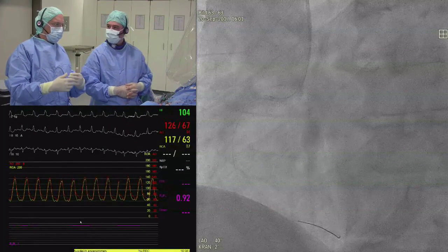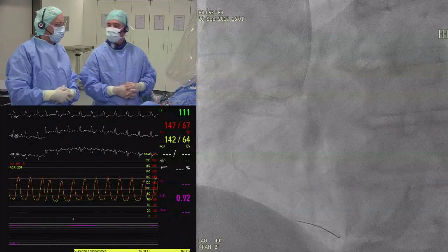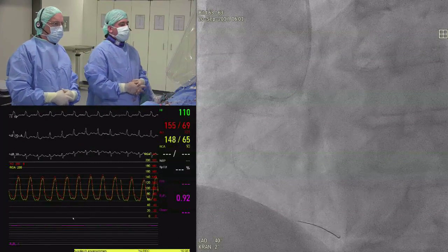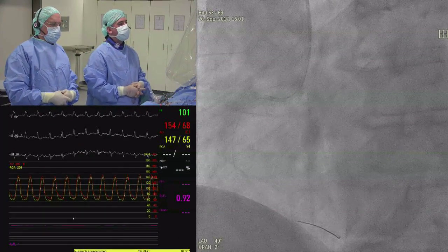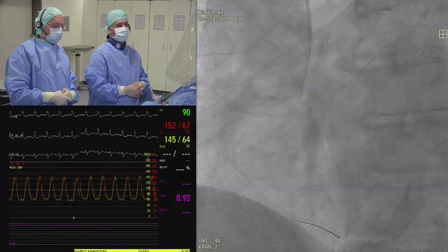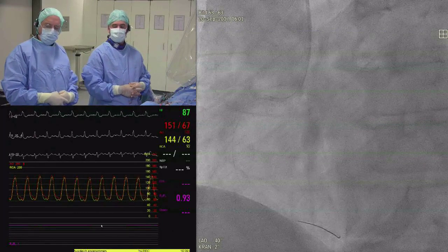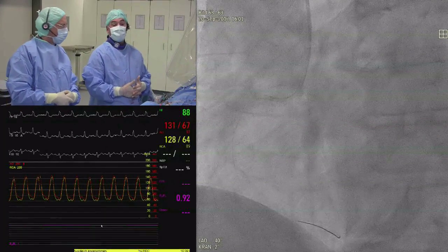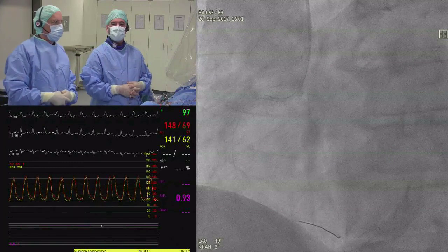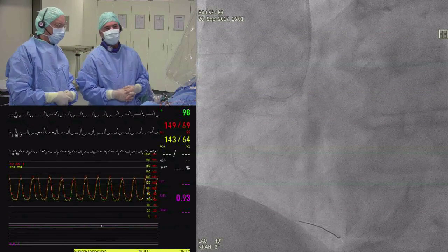Yeah, unfortunately, you can't get iFR and FFR on all the wires because of proprietary software. Apart from the technical difficulties in tracking the wire, drift is one of the major issues, and I think the optical wires perform very well in this respect. Yeah. I think Opsens is probably the best when doing this comparison. We will see if it holds up if you do the pullback. So I'm keeping my fingers crossed. But my experience is that's one of the big advantages for sure.